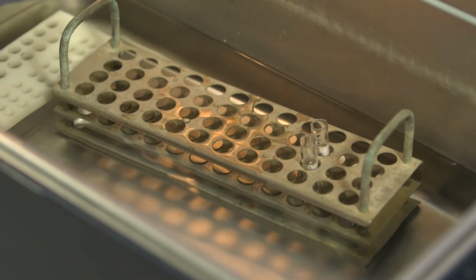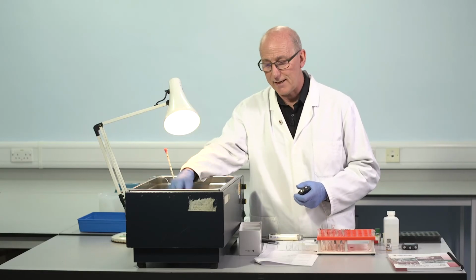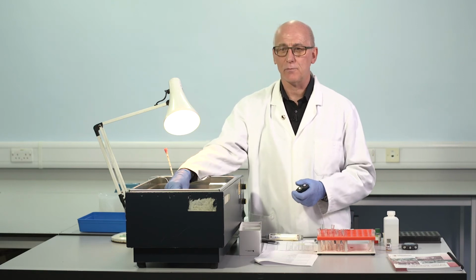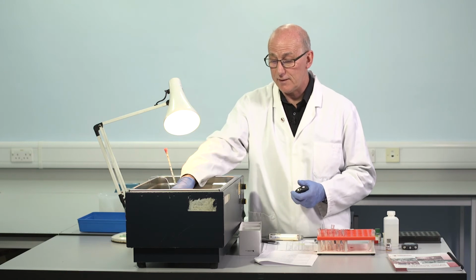If we anticipate a rather high level of factor VIII, again we may have some clue about that before we undertake the assay. Perhaps a mild von Willebrand's patient who's been treated with DDAVP, maybe a mild haemophiliac who's been treated with DDAVP.